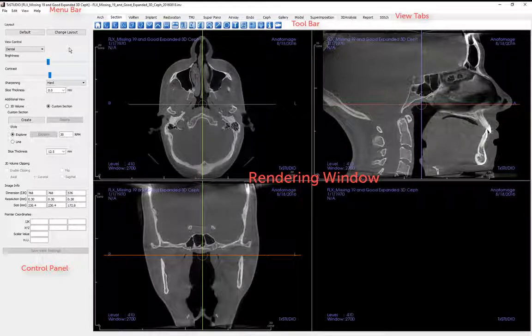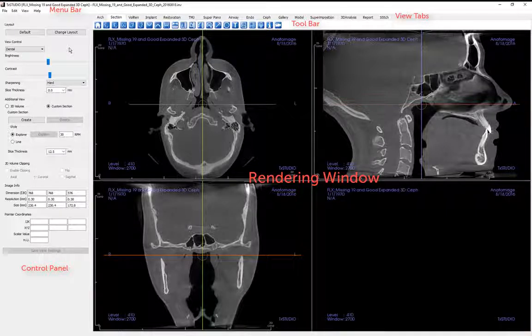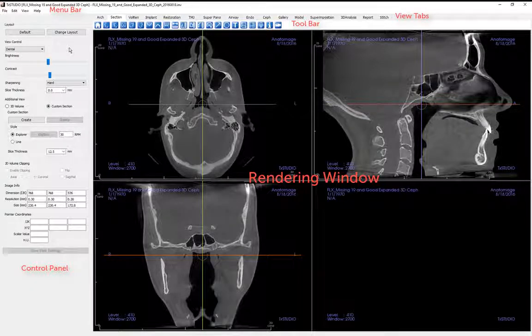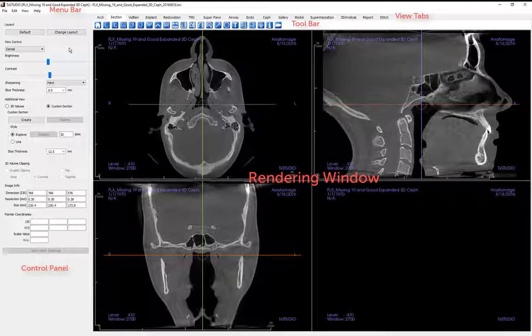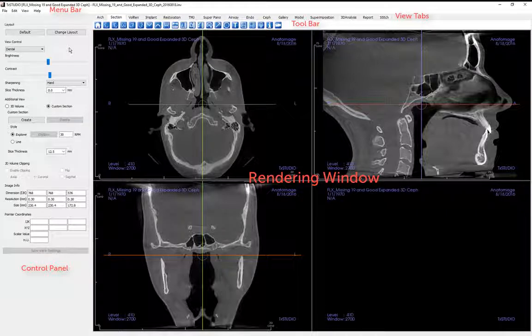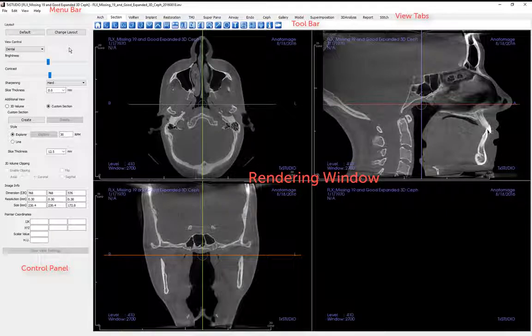The section view rendering window shows the patient in three-dimensionally reconstructed views and allows you to explore the internal structures in never-before-seen views of the patient. These reconstructed volumetric data sets of the patient scan are displayed in three viewing windows: axially, coronally, and sagittally as multi-planar reconstructions of the image structures.